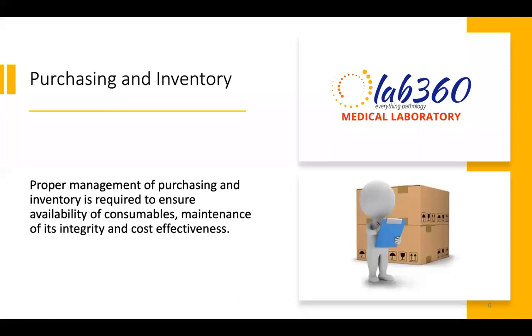Then within the equipment, you need what we call reagents. These are chemicals that are mixed with blood samples collected from the patient to produce a result. Every good laboratory must have a good inventory system that ensures that these consumables, needed for the production of good and quality results, are readily available and are stored in such a manner that their integrity is maintained.